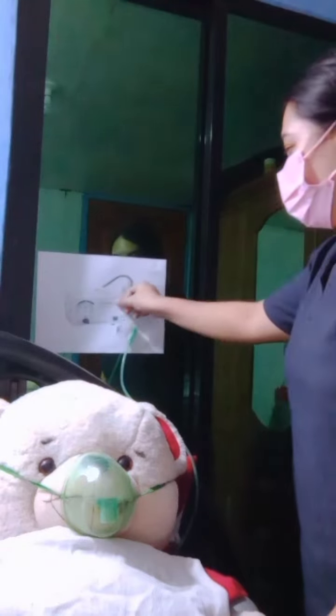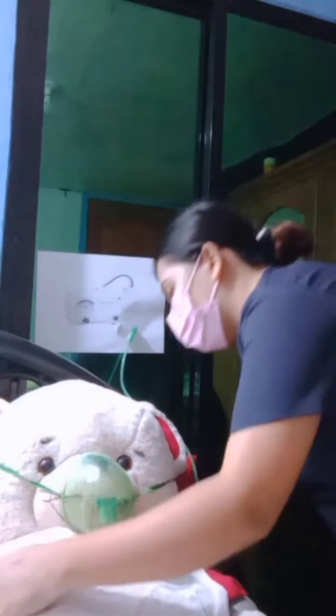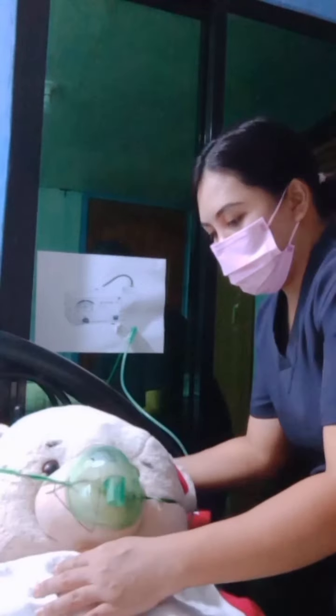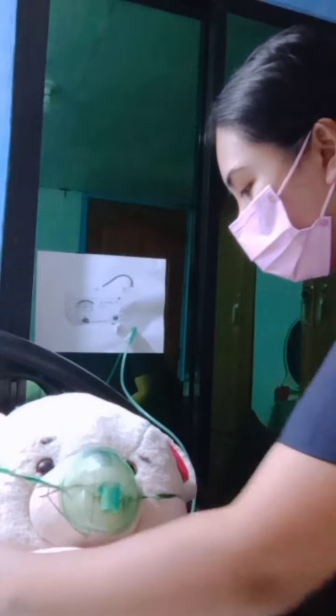When you finish suctioning, detach the catheter from the connecting tubing. Loop the catheter around the fingers of your dominant hand and pull your glove off inside out around the coiled catheter to isolate any contaminants. Remove your other glove and turn off the suction device. Are you doing okay, Mom?